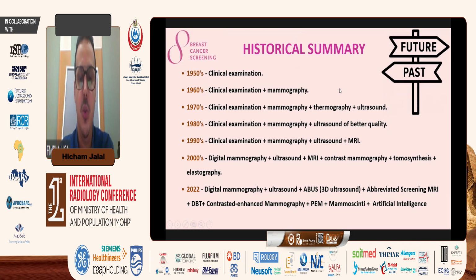Now I would like to show you the evolution of technology by years. In the 50s, we had screening by clinical examination, and in the 60s, mammography, and in the 70s, thermography and ultrasound. In the 80s, we had ultrasound of better quality, and in the 90s, the introduction of MRI. Then in 2000, we have MRI, contrast mammography, digital tomosynthesis, and elastography. And nowadays, a lot of techniques emerge, like ABUS 3D ultrasound, abbreviated screening MRI, DBT, contrast enhanced mammography, positron emission mammography, mammoscintigraphy, and artificial intelligence.